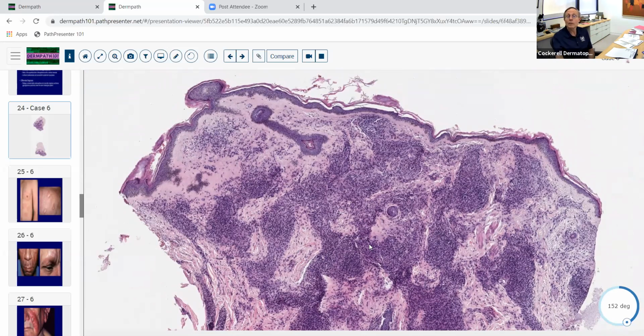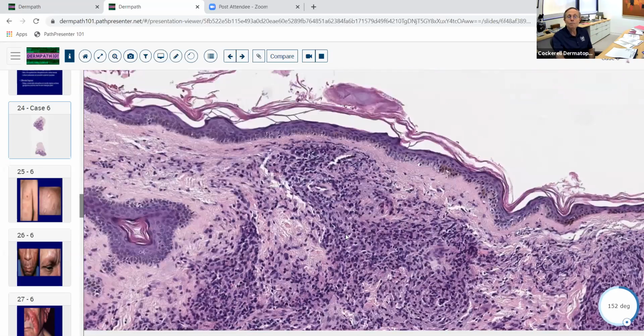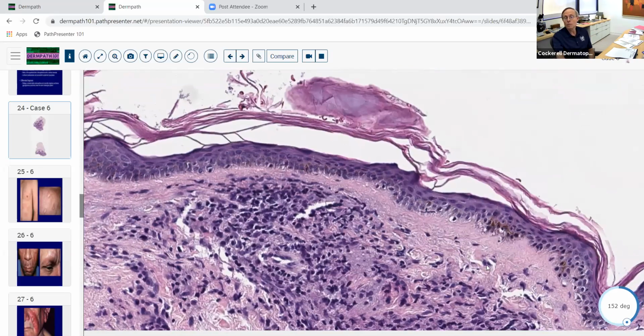They usually also will give you some epidermal changes. And notice this pattern here. We've got a Grenz zone. Grenz, German word for frontier. So it's the area between the inflammation, and I guess this might be the little checkpoint up here or something, but there's a zone, a no man's land, if you will, between the epidermis and the inflammation in the dermis here. So basically, we've got a diffuse nodular granulomatous and lymphocytic infiltrate, and in this case, this was an example of Hansen's disease.